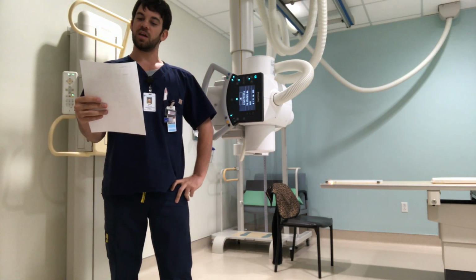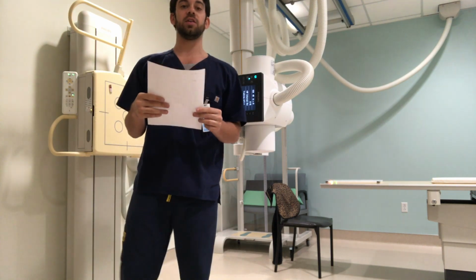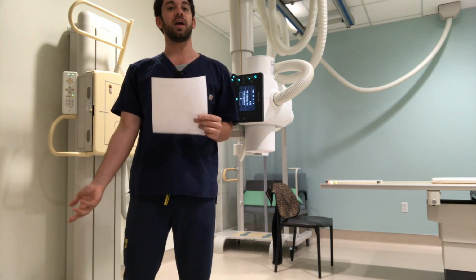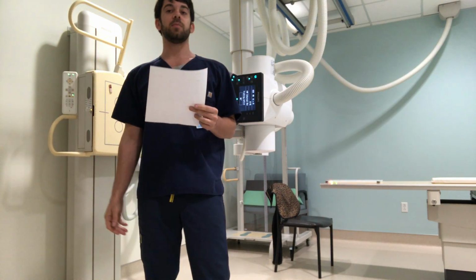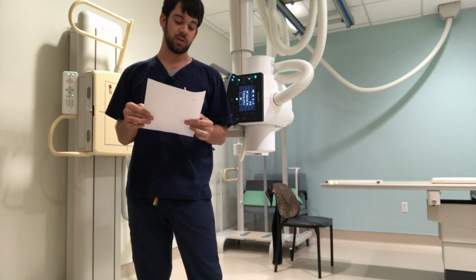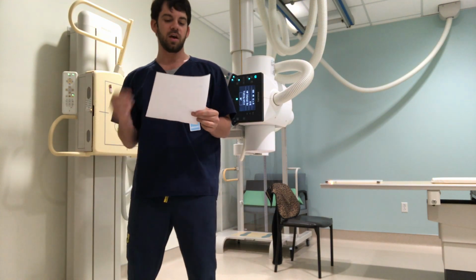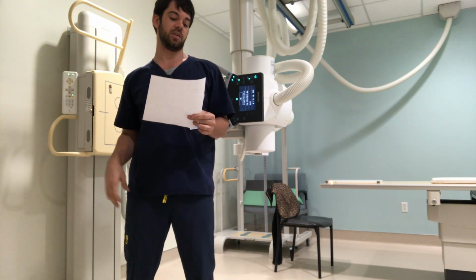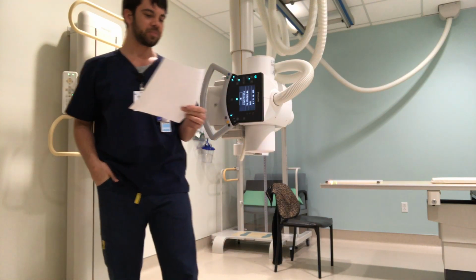My patient has a right shoulder pain, so we are going to be doing an internal rotation, which will show us the lesser tubercle. We're going to be doing an external rotation, which will show us the greater tubercle in profile. We're going to be doing a PA oblique projection, also known as the scapular Y view. That's good to show us some dislocation from the humeral head. And I'm also going to be doing a superoinferior axial shoulder joint projection.